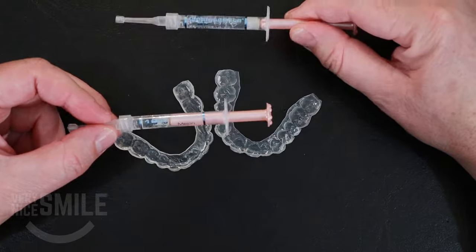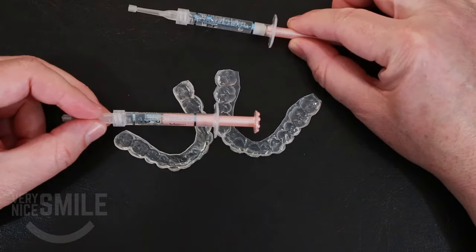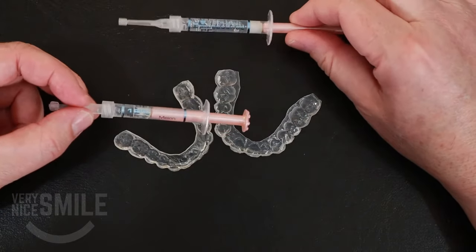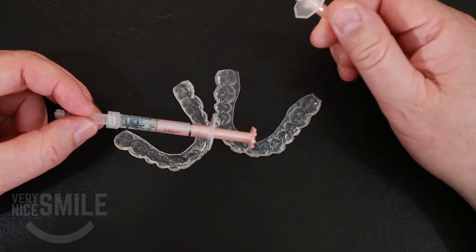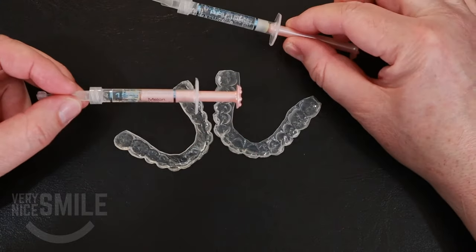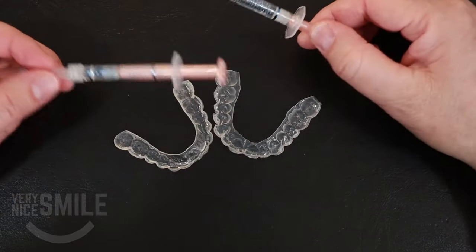For the tubes of gel that you haven't used yet, you'll get a longer shelf life out of them if you stick them in the refrigerator. Don't let them freeze, but just on the door of the fridge is fine — it'll keep a little bit longer. If the gel gets too old or gets too hot, another thing to know: even if you have some old gel that's past its expiration date, it'll still work as long as it hasn't separated, and as long as it comes out as a gel rather than a liquid, you can still use it.